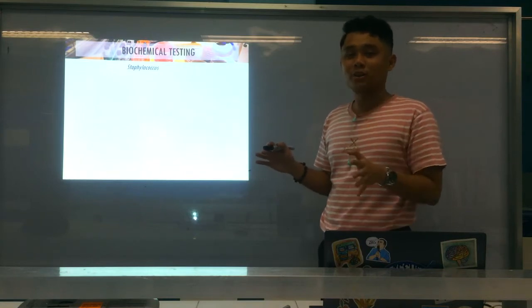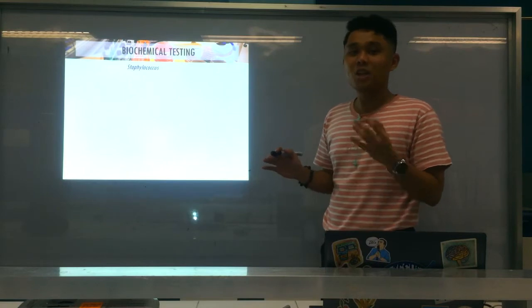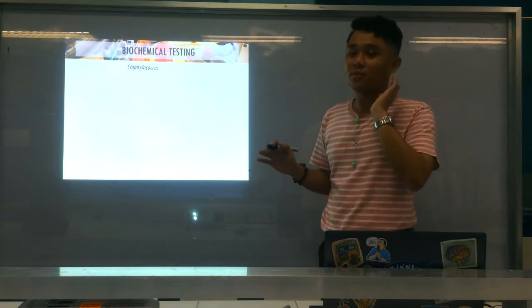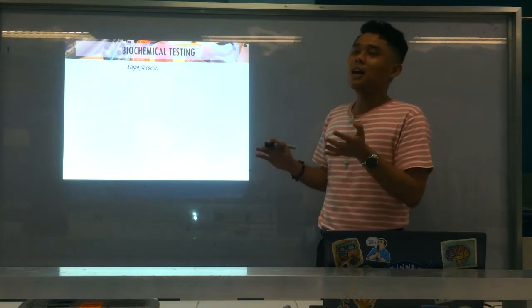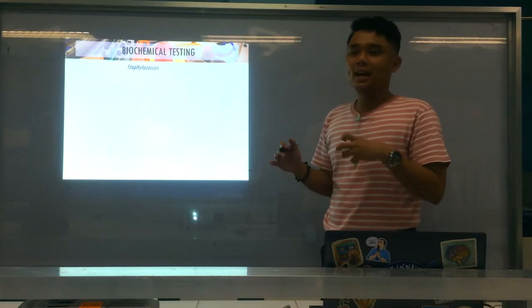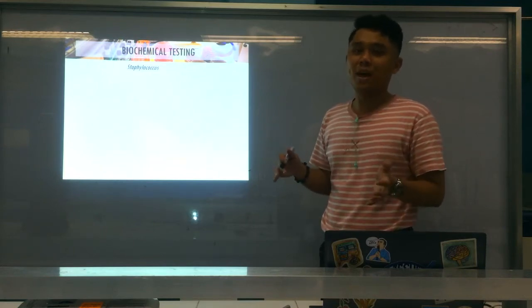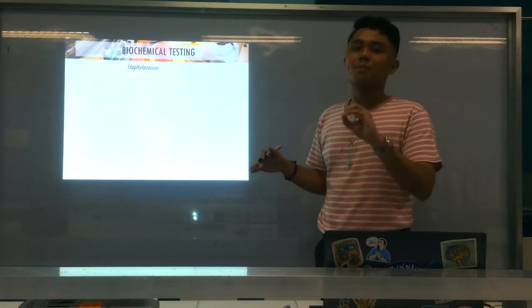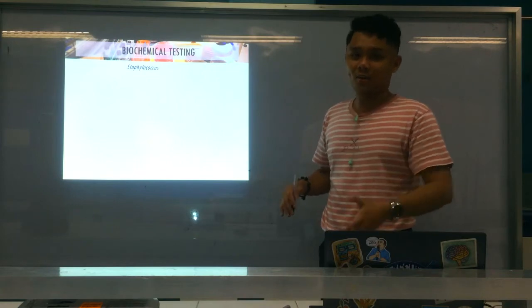If you have 1 or 2 tests that are well established to differentiate the two, then use them, right? At least it's more cost-effective, okay? Alright, so again, we want to identify our organism as efficiently as possible, without spending a lot of reagents, without spending a lot of time. So the quickest way possible, but efficient and accurate in performance. Okay? Alright.